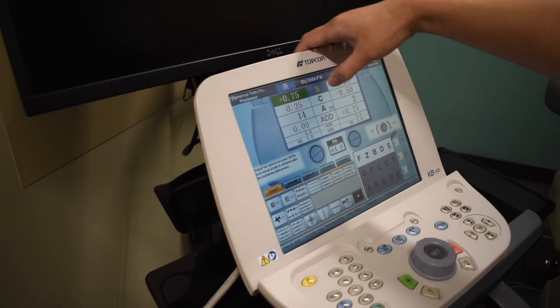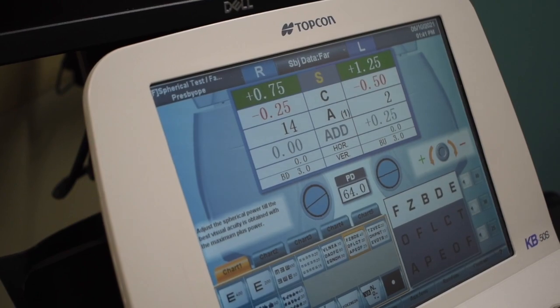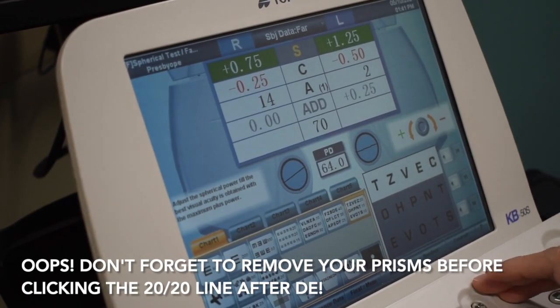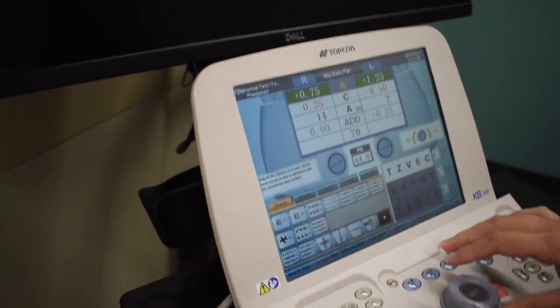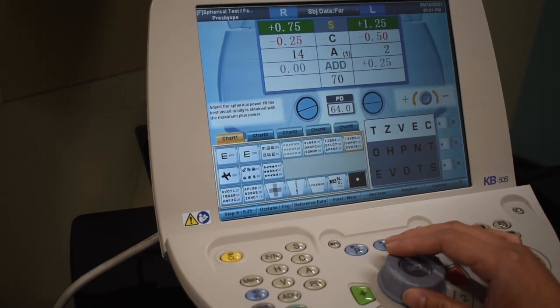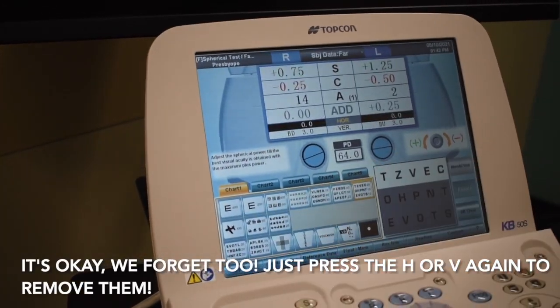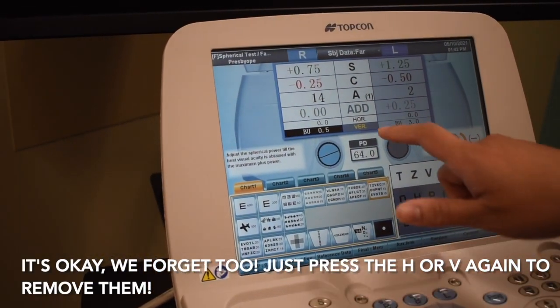That is his equalization. Now we are going to do the BSBVA — bringing up the 2020 line, pressing the arrow to isolate. Dr. Hefner, do you see any of those letters? He should not be seeing any letters. Oh wait — I forgot to take out the prism. So we want to make sure you take out the prism. Let's take that out.